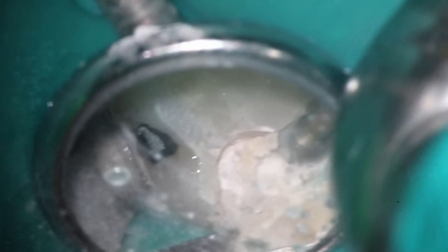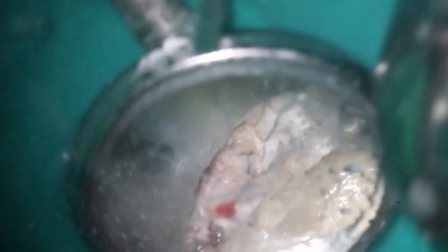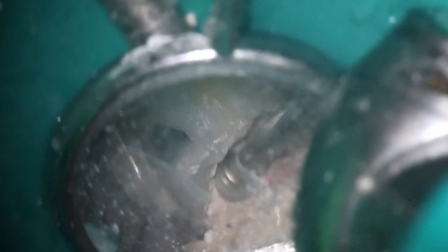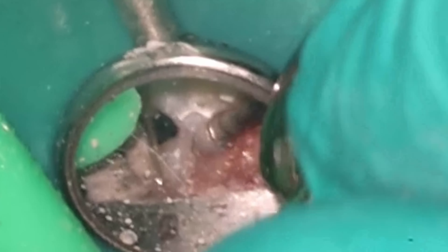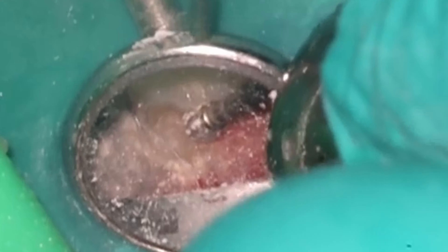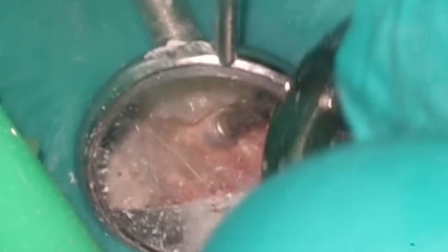Removing all the caries here, you can see it's really soft. That decay is not happy — it's very active here. By the time we get this all done, we'll have exposed both the palatal and the distal. A lot of that comes from gingival overgrowth into the area rather than the actual canal. That amalgam was not really held down very well and just popped off because it was surrounded by decay as well. Lots of caries in this case.